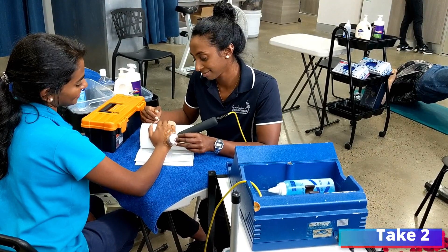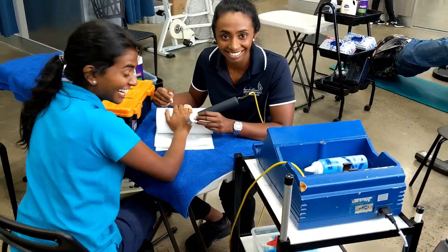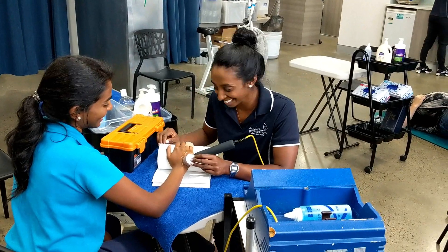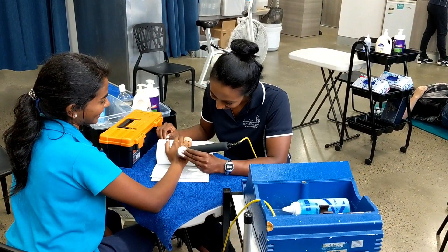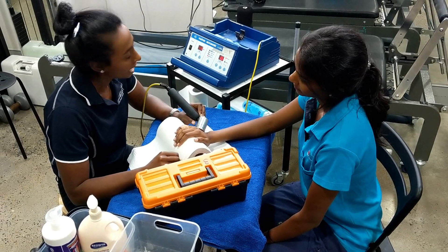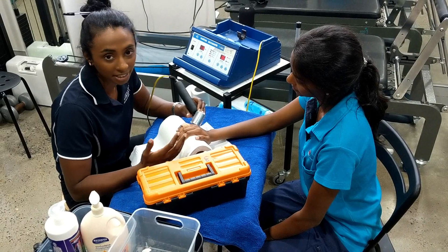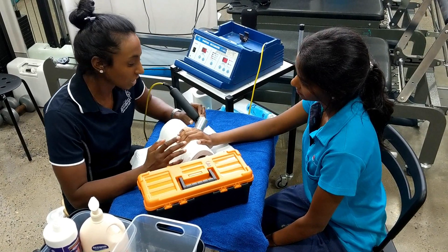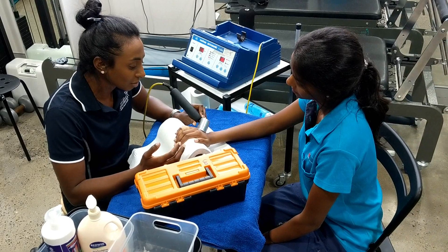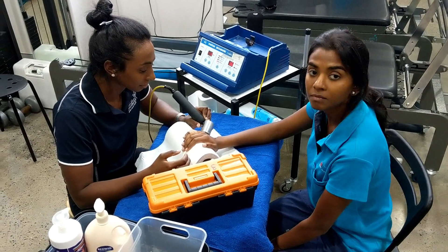How long do you usually do this, by the way, and how often? So in the meantime it's gonna help.